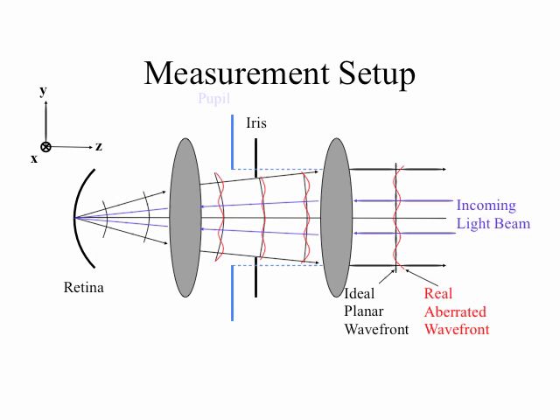Now, who cares to measure what the aberrations are coming out of the eye? What physiologic value, what clinical value does this have for us? Well, it doesn't have any, but the wavefronts, the description of the wavefront of the rays of light coming out of the eye are, of course, identical to the description of the distortion of rays of light coming into the eye, the description of the wavefront going into the eye. If the eye is presented with an ideal planar wavefront, that planar wavefront will be distorted, aberrated in the same way going into the eye.